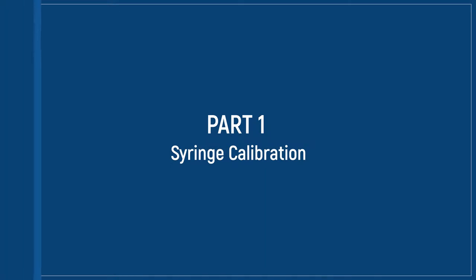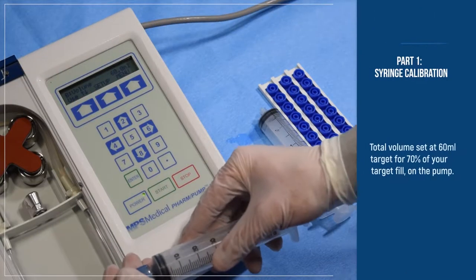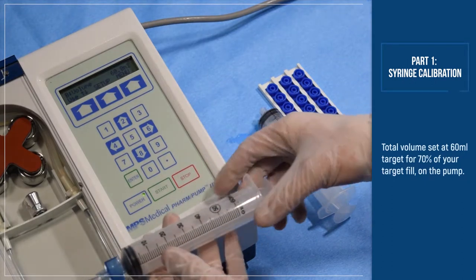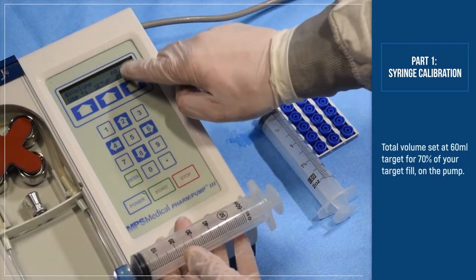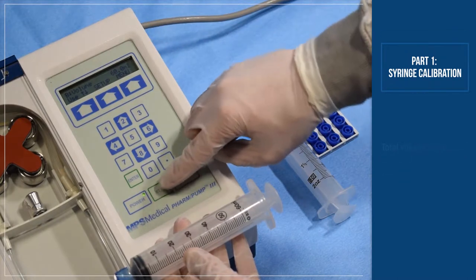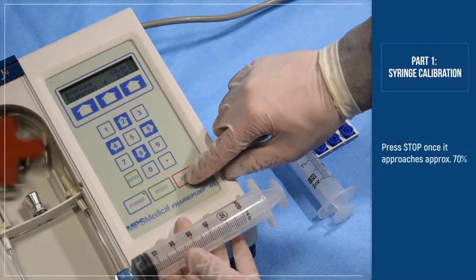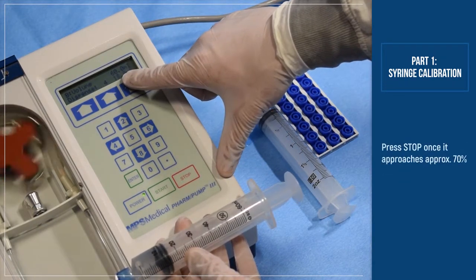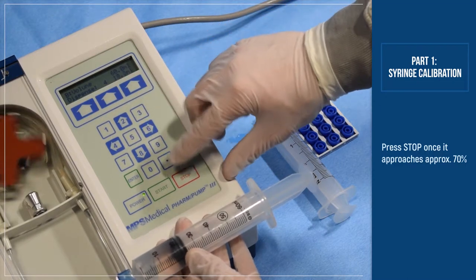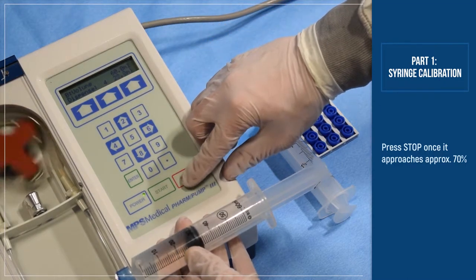Part 1, Syringe Calibration. Target for approximately 70% of your target fill. In this example, we use 60 mL as our target total fill. We will stop at approximately 70% using the barrel of the syringe as our measurement.